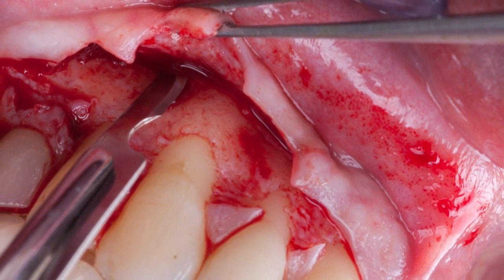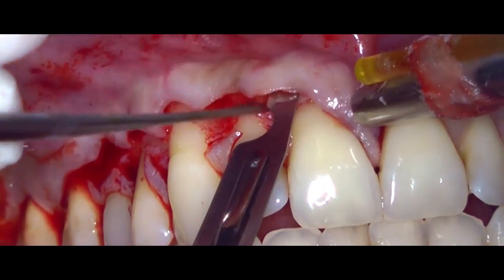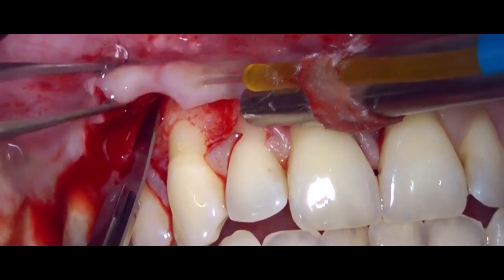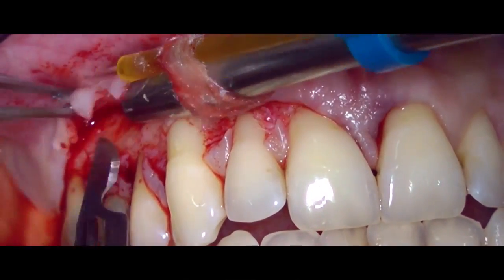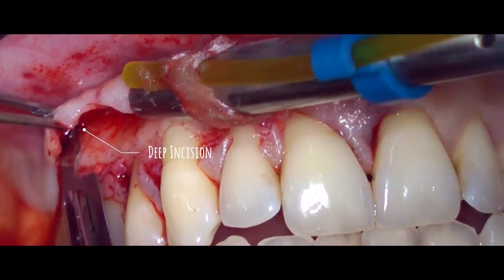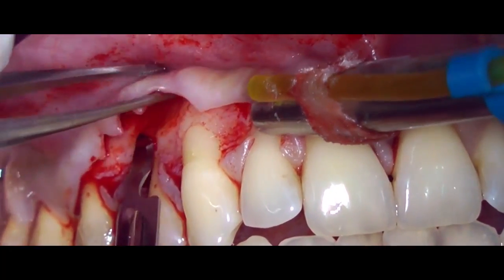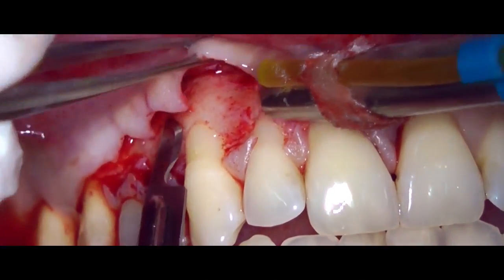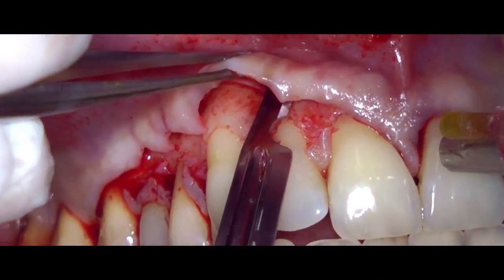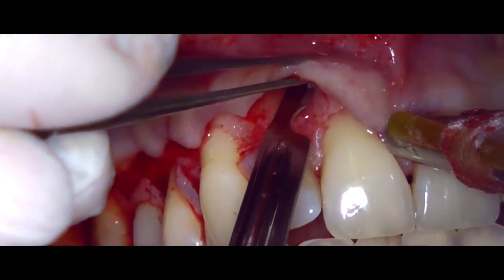Now that we have reflected the tissue for about 3 mm, it is time to continue the soft tissue dissection once again in a split thickness fashion, cutting the periosteal muscle insertion. Zucchelli has described this as a deep incision followed by a superficial incision that removes the superficial muscle insertion remaining on the flap. The combination of these two incisions will allow for complete and effective mobilization of the flap.